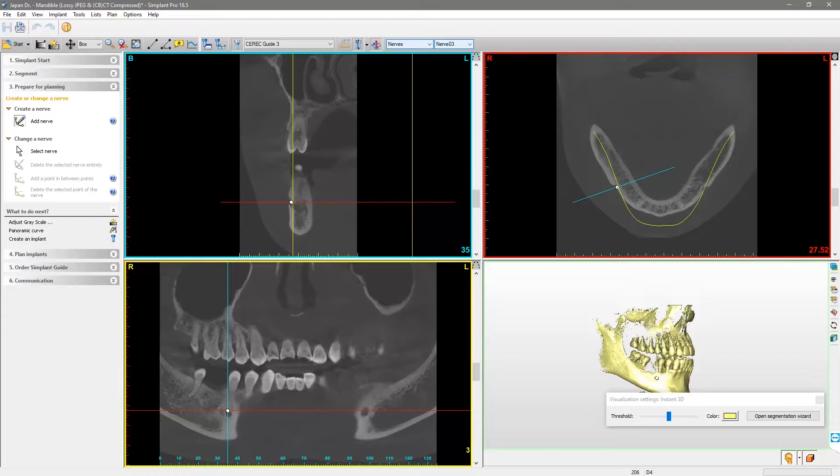If it becomes difficult to continue tracing the nerve in this view, move your mouse to the panoramic view and scroll through the images to continue placing points. The cross-section view can be used for this purpose as well.